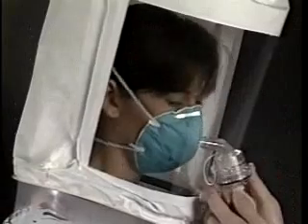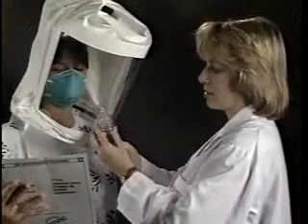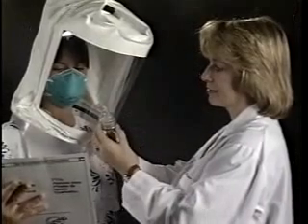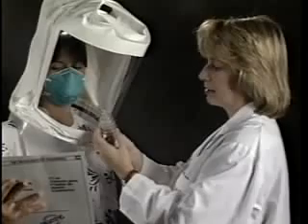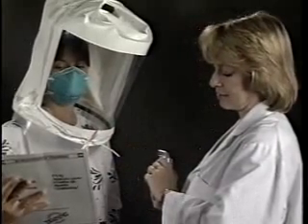Fourth, have the subject breathe through their mouth and nod their head up and down, with about 1 nod per second. Instruct the subject to inhale in the up position when they are looking toward the ceiling. Fifth, ask the subject to read a paragraph aloud and slowly while breathing through their mouth. A reading called the Rainbow Passage is included in the print instructions for the 3M Qualitative Fit Test.